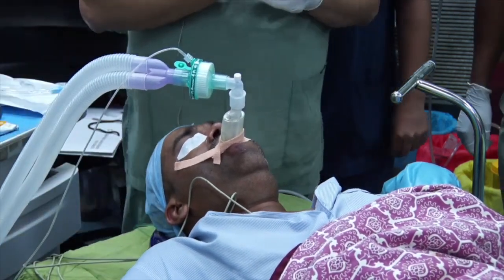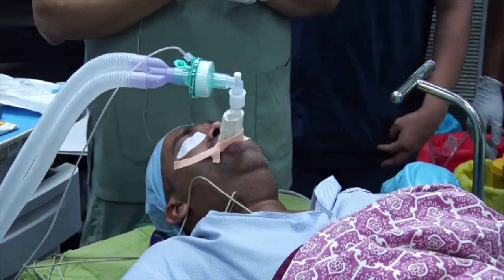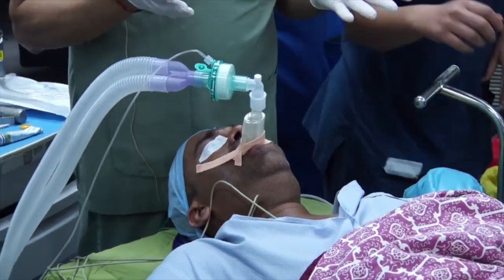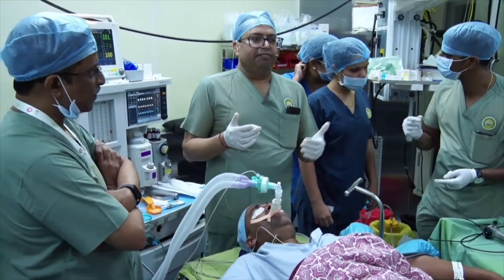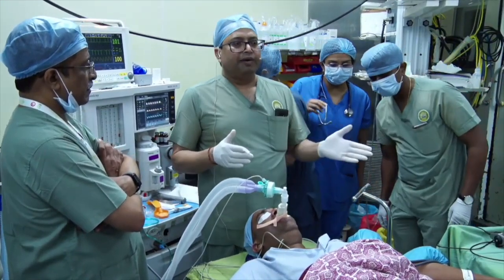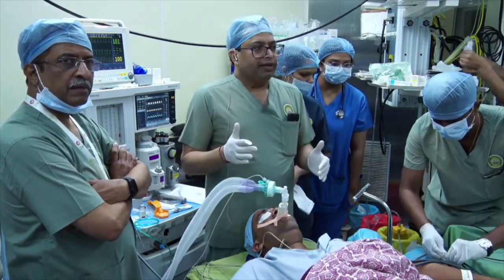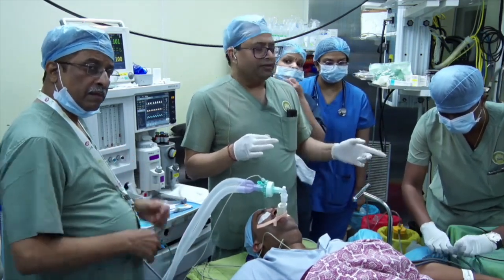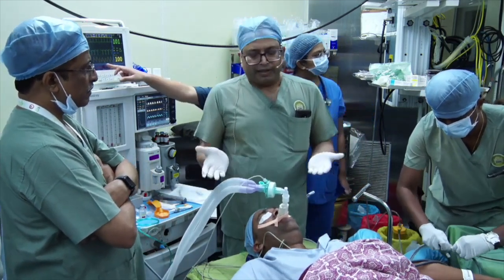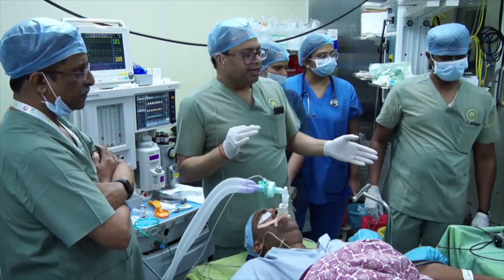Next we'll be showing the Aintree catheter technique. This can be used as a rescue technique — for example, if you have a very difficult airway and you've managed to get the i-gel in, and then you have to decide whether to wake up the patient or continue surgery with a definitive airway. In that case, you can use the Aintree technique to intubate the trachea. If an endotracheal tube is not required, you can continue surgery on the i-gel.